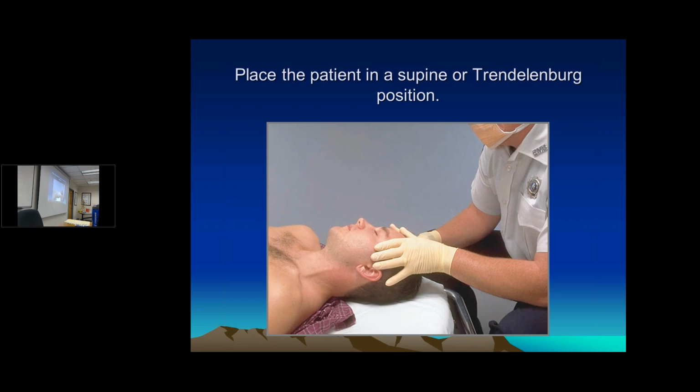So don't be fooled by it. Typically, you're not going to get this great outflow with the internal jugular. It's the external jugular that you will. So stretching the head to one side means that you are actually pulling up that vein. Some other tricks along the way that we'll teach you is that your Trendelenburg does help as far as getting the feet up towards the head. So again, you want to be careful in terms of head injury, right?